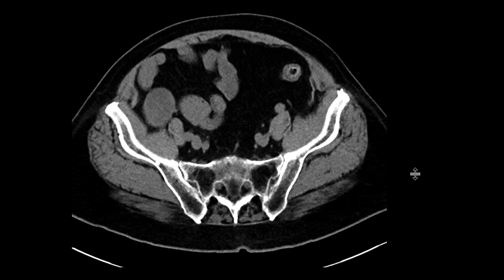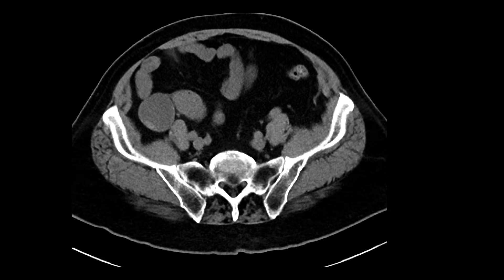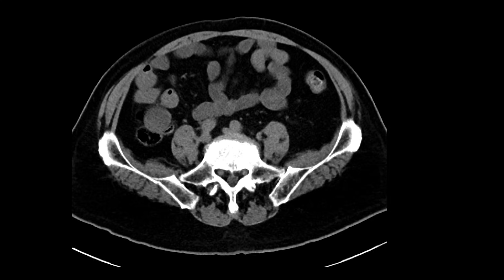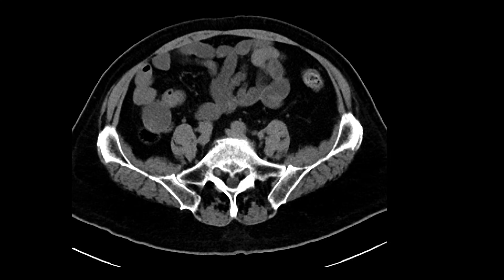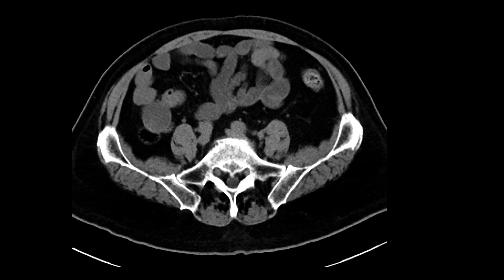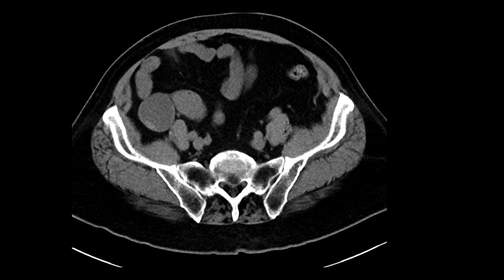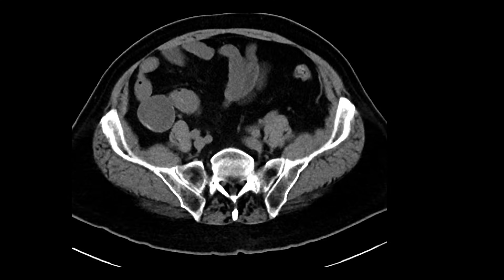We really do have to look at everything carefully. You can see right here in the right lower quadrant there's a loop of bowel that looks fluid-filled, a little bit distended. It kind of looks like small bowel, except for the fact that it's arising from the base of the cecum. You can see the terminal ileum cephalad to it, and more inferiorly at the cecum, there's this fluid-filled loop of bowel that is blind-ending.